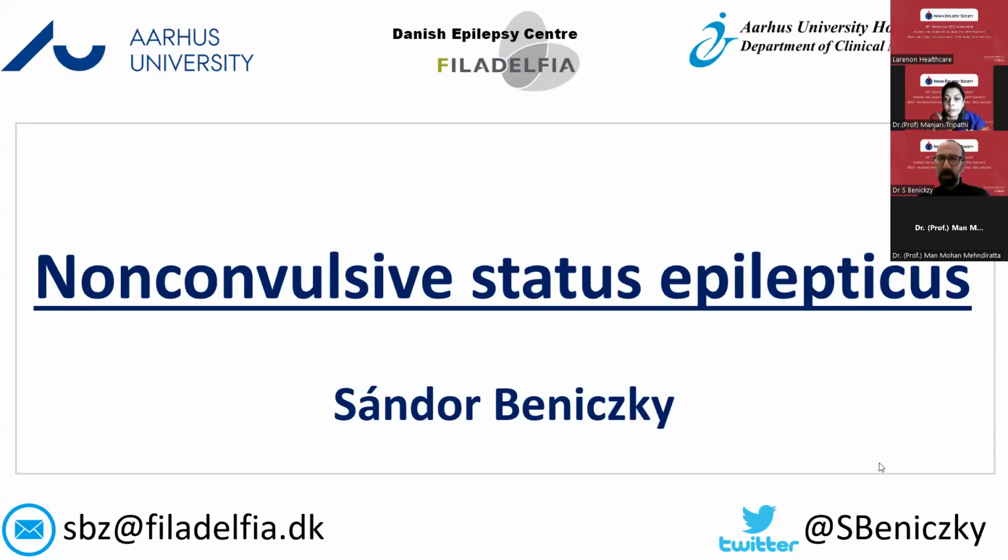Other than that, we do more and more high density EEG, and only in patients, because we finished the research studies. We do the MEG only for clinical cases and only when the high density EEG is not informative. That basically dropped the number of MEGs to 1/3 of what we did before. Okay.